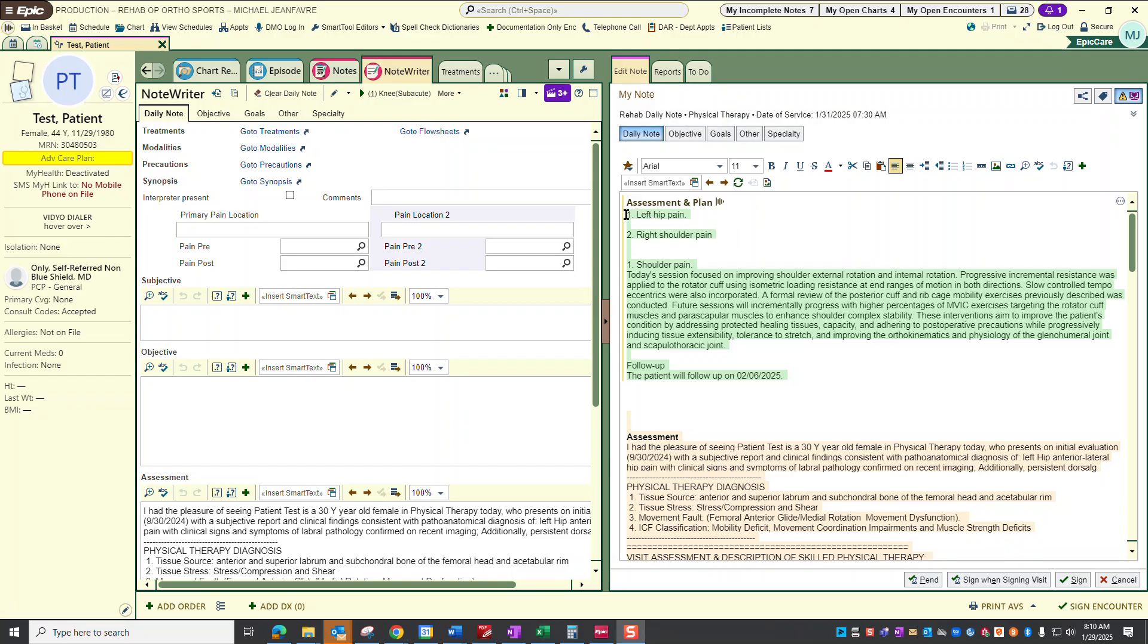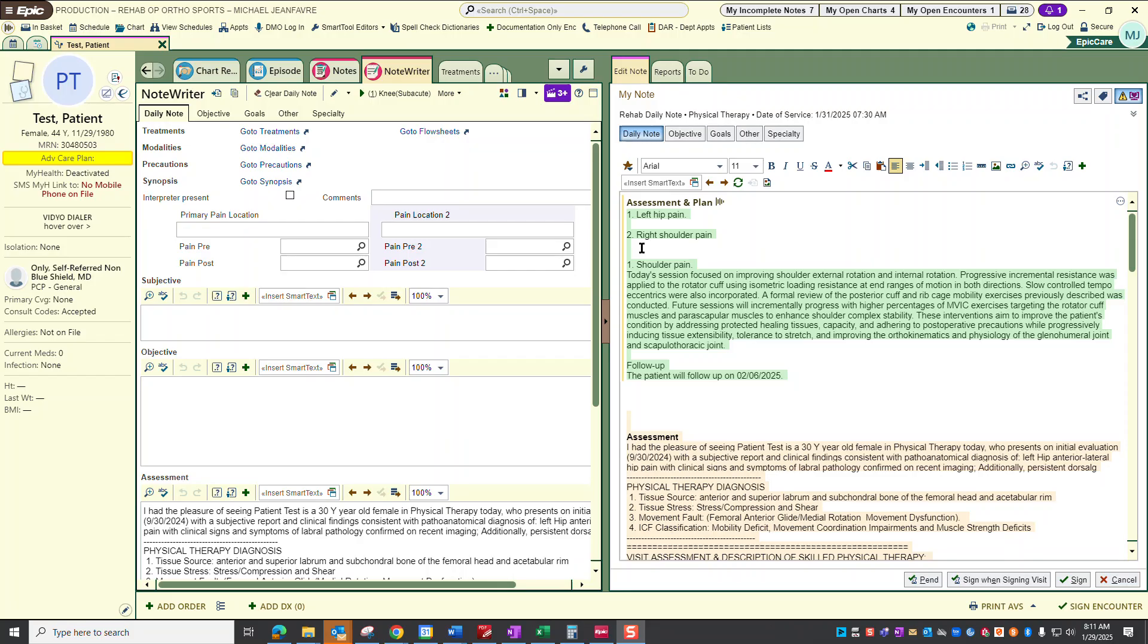So that would suffice. Before I dictate anything into the new note, I can go back, delete the previous information within that smart section, and touch it and manipulate however I want to, as long as I haven't dictated within this new note, because it doesn't break the link. I can go ahead and just start to populate and dictate for this encounter and it doesn't break the functionality.